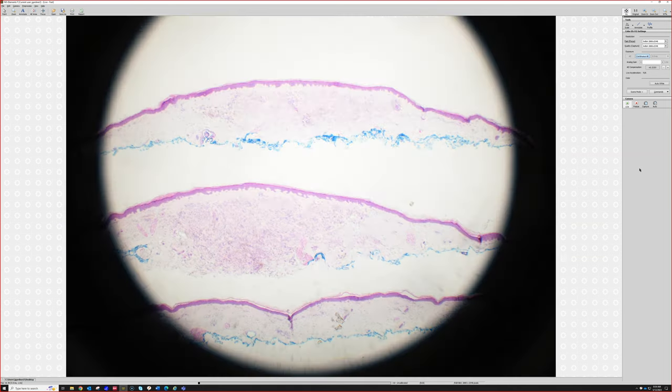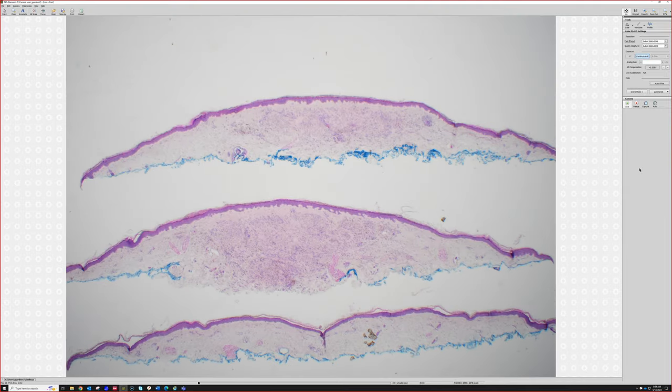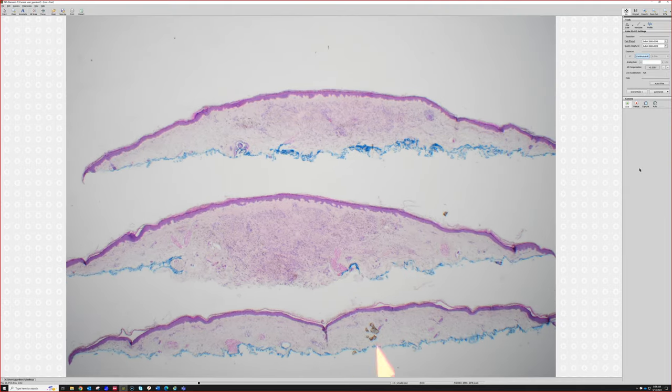Okay, from 2X, any takers? The stuff on the bottom piece is just junk on the surface of the slide. Dermatofibroma. That is a great thought, and the main differential. This is not dermatofibroma, but that is the main mimic of what we're seeing here. So I'm going to leave that in because you said exactly the kind of thing that you should be thinking, especially from 2X.